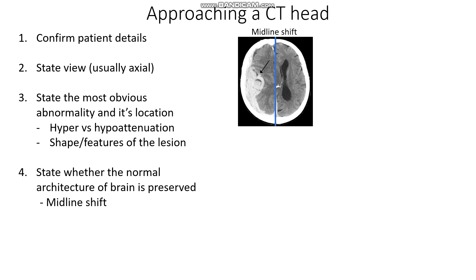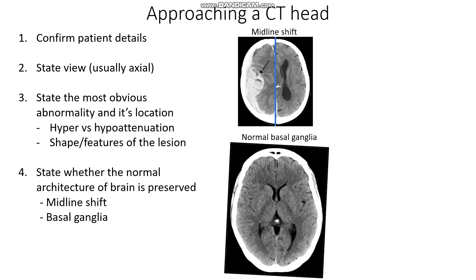The next thing I'd like to examine are the basal ganglia. The basal ganglia are structures which are very important in initiating and coordinating movement, and often in conditions such as lacunar strokes these structures may become infarcted. If we look at the basal ganglia here, we can spot three structures: the head of the caudate nucleus, then the thalamus, the lentiform nucleus, and the internal capsule — all of these structures together form the basal ganglia. Any loss of white-grey differentiation suggests there might be a stroke in this area.